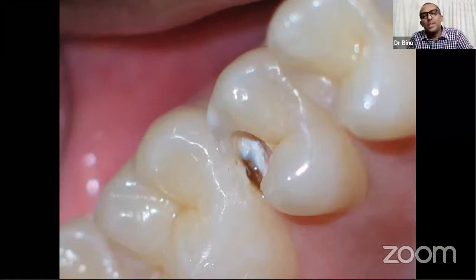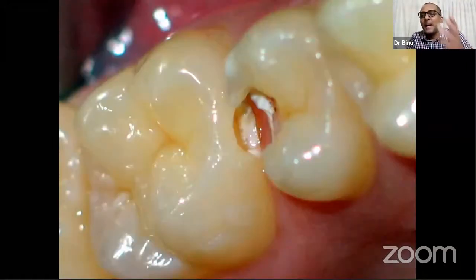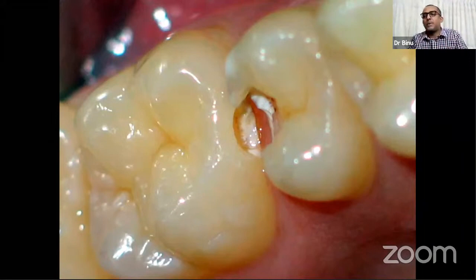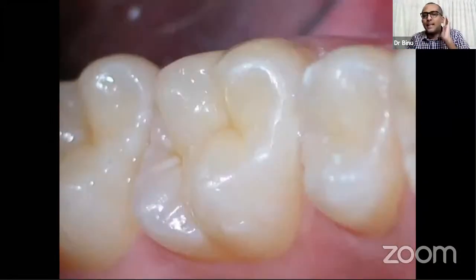Now, this particular patient, I cleaned up completely. You'd never know that the mesial of 6 can be many times bigger than the original cavity you started with. Practitioners here will understand what I'm talking about. Now, you have to fill 6 first, then 5. Fill 6 and 5 individually. Show pictures. Send it to their WhatsApp.